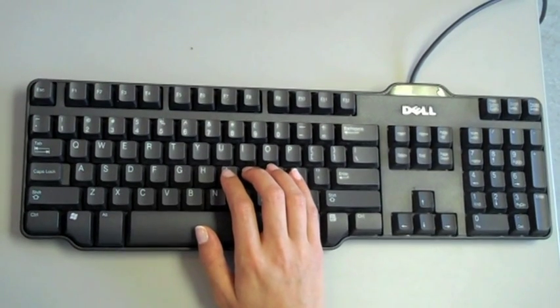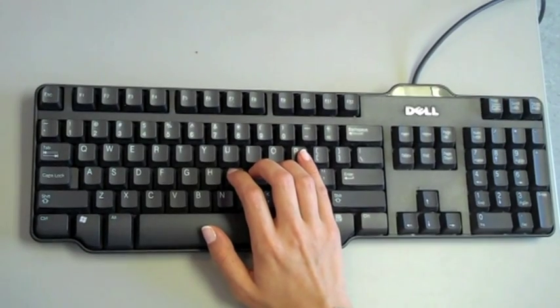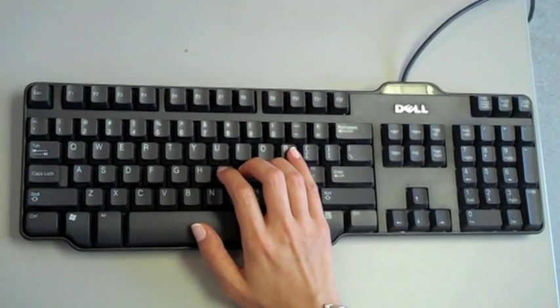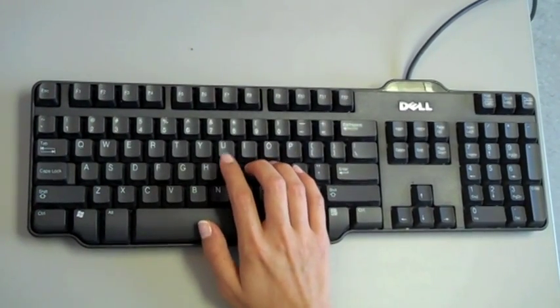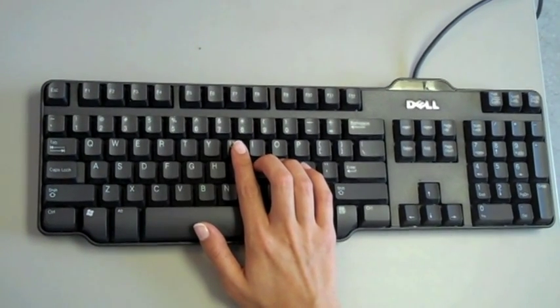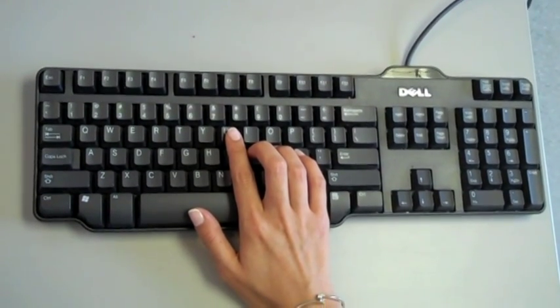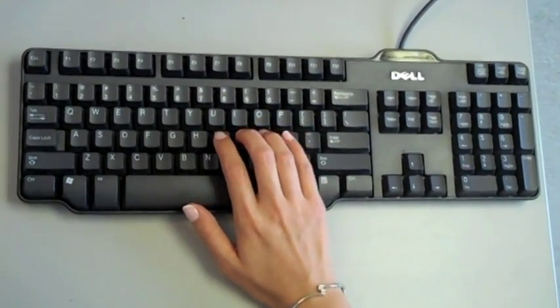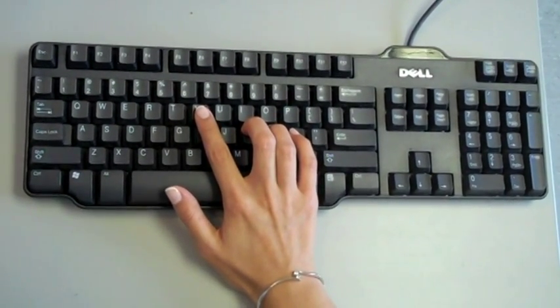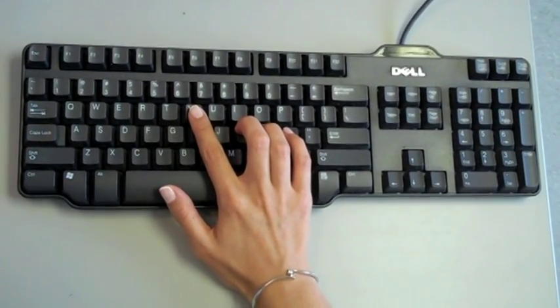The participant will be typing the word puppy. You will notice hyper-abduction of the 5th digit in order to reach for the P key. You will notice MCP flexion of the 2nd digit, PIP and DIP extension of the 2nd digit. You will notice hyperextension of the 2nd digit in order to reach for the Y key.